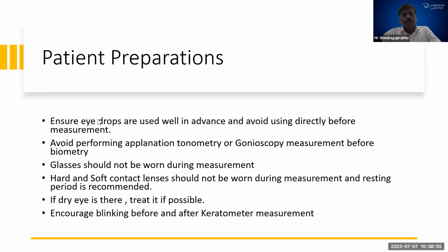When it comes to patient preparation, we need to brief the patient about the procedure in simple terms, so that the patient can easily understand. When they understand, they can cooperate. We need to tell what we are expecting out of the process and what we are looking for from them. It has to be in very simple language. Like, there will be a red light. When I say open your eyes wide, simple things we need to tell beforehand, so that they can work in tandem with us.